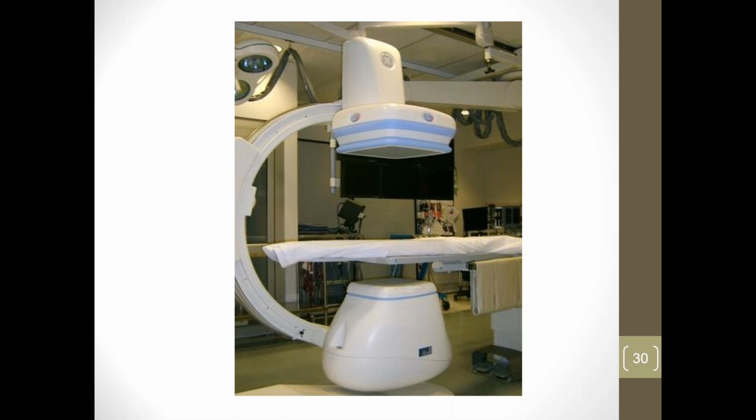The X-ray tube is down here, the X-rays go through the table, then through the patient, and then hit the digital detector. In simplistic terms, think of it as a giant electronic Etch A Sketch. Each X-ray beam will hit the grid inside the detector, and the grid will record those X-ray beams and turn them into an electronic signal.